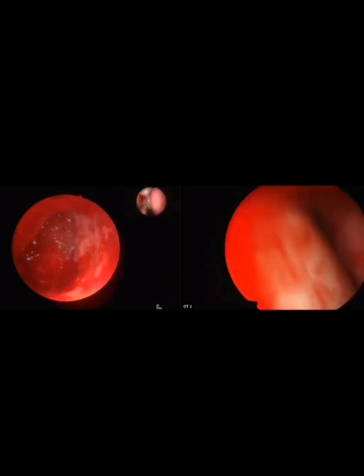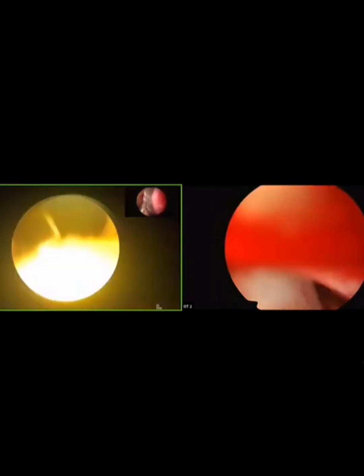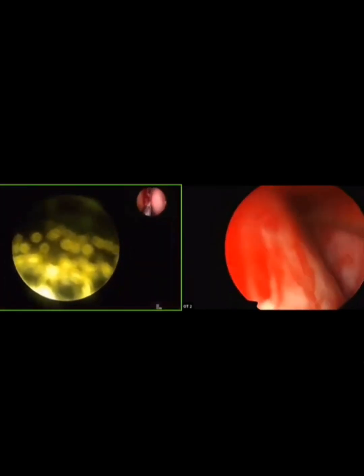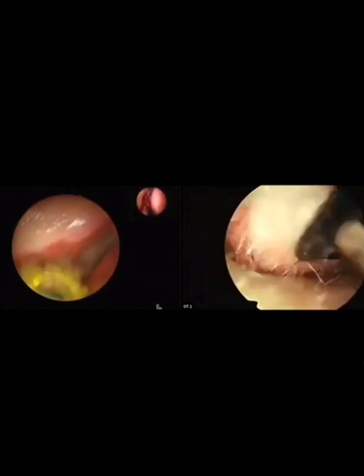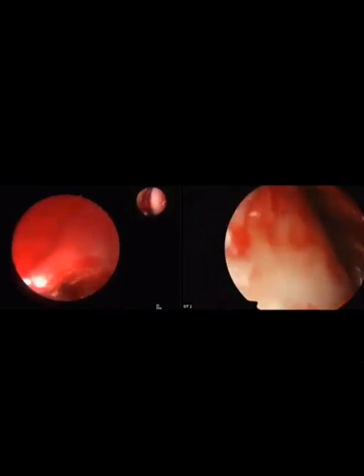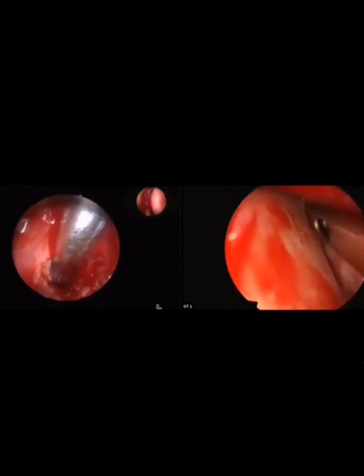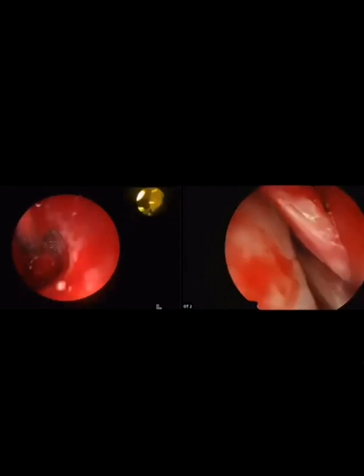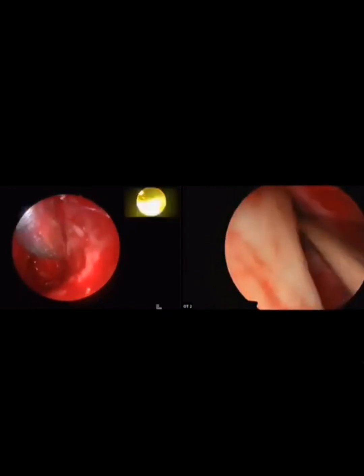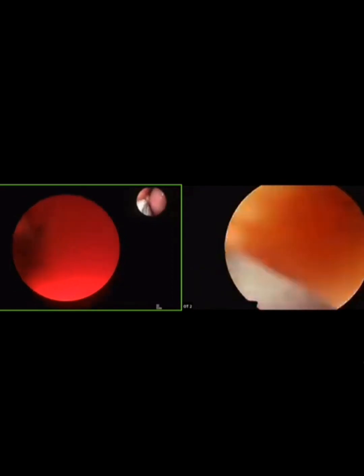wall, no? In 70-degree, one can see What, sir? the wall also. Enterolateral wall. Wait, sir. I will show you. So in the third small PIP, 60 we then. have the third case of extensive polyposis. It is done by Dr. Sorin Shah. And because we also have another extensive polyposis, only PIP 1 audio is Oh. presented. Sorry, is doing, no? Third one. PIP. Wash.